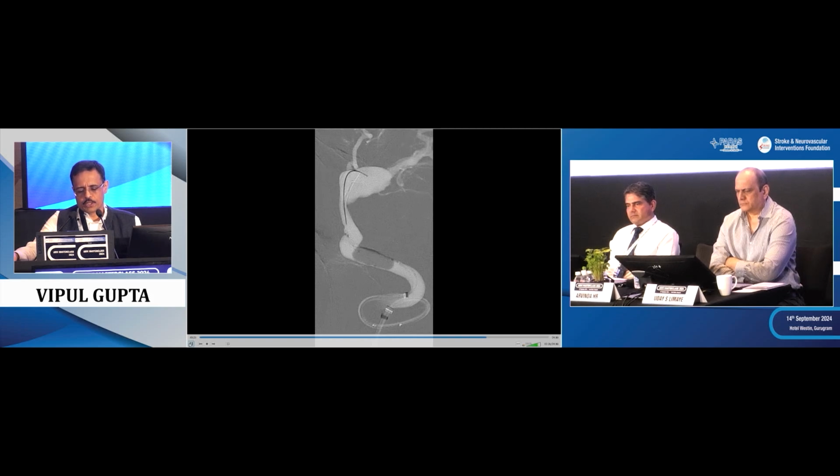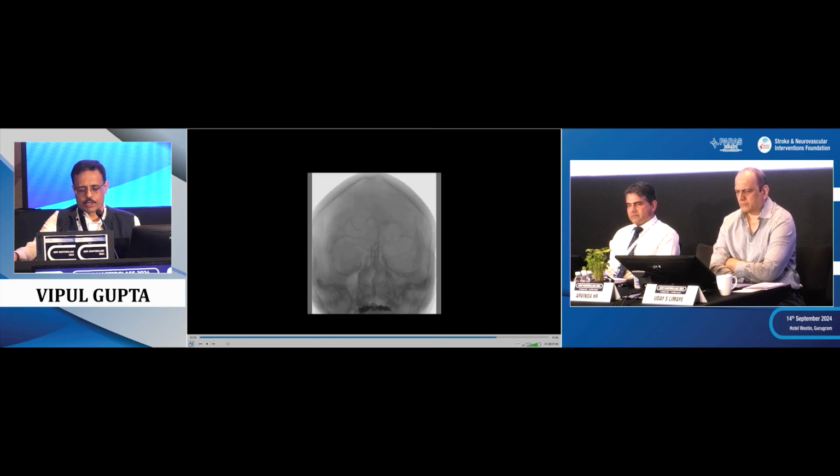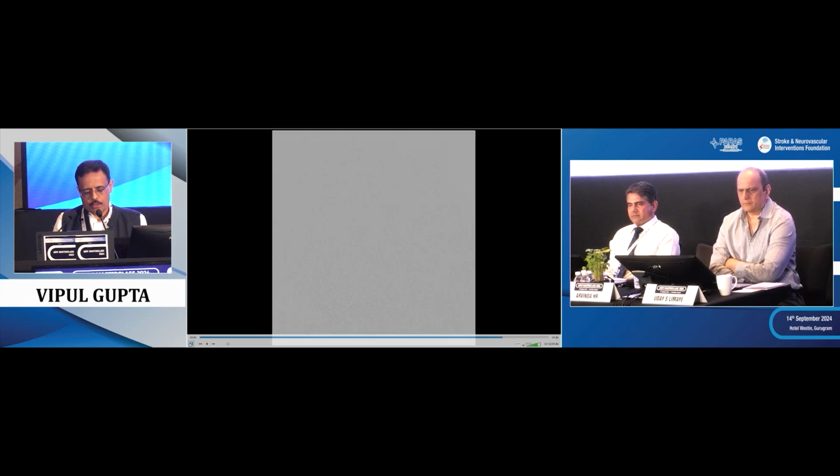And we did angioplasty here as well. I don't have the pictures. After angioplasty, we did another vaso CT, and it looked reasonable. I watched it for a while and left it there. Didn't deploy a stent, as you mentioned. And now we were happy, we are done.